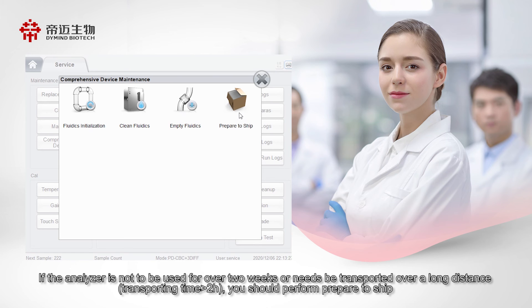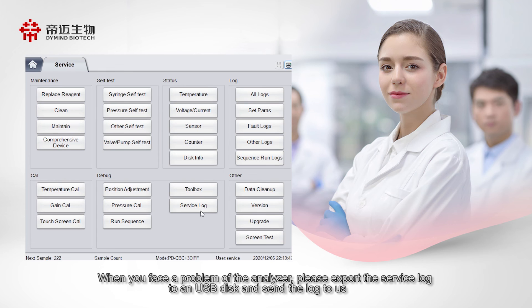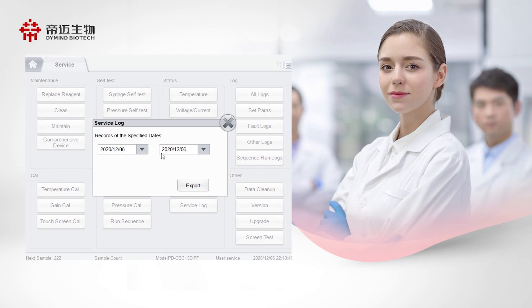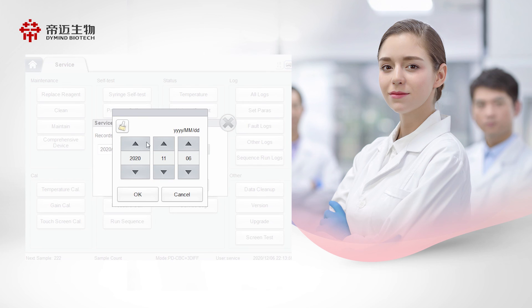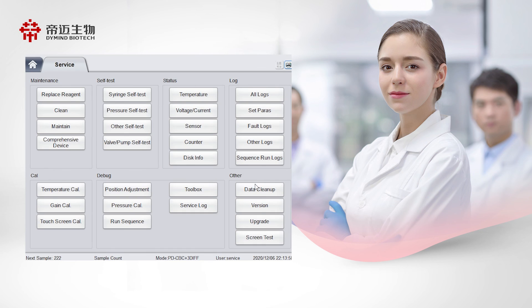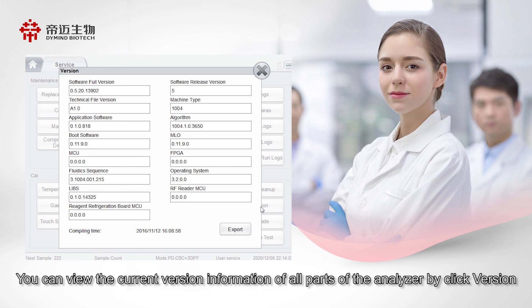If the analyzer is not to be used for over two weeks or needs to be transported over a long distance, you should perform Prepare to Ship. When you face a problem with the analyzer, please export the service log to a USB drive and send the log to us. You can view the current version information of all parts of the analyzer by clicking Version.